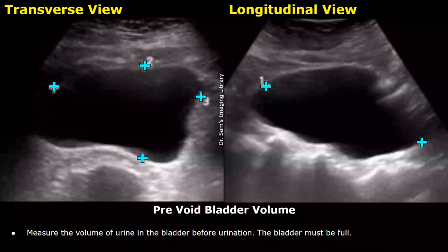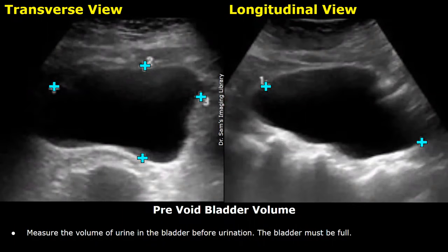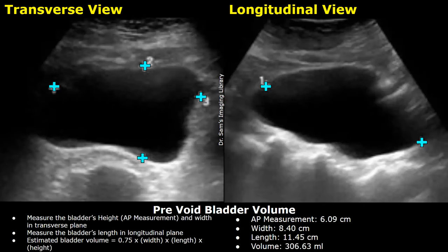Hello everyone, this is Dr. Sam. This video is about pre-void and post-void residual volume bladder ultrasound. Pre-void bladder volume is measured when the bladder is comfortably full, and the measurement is taken before urination.